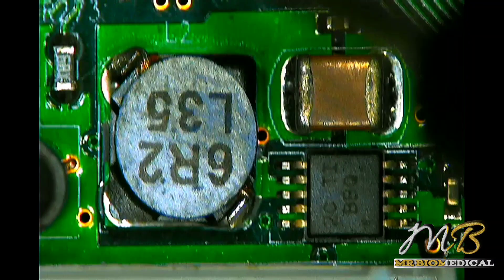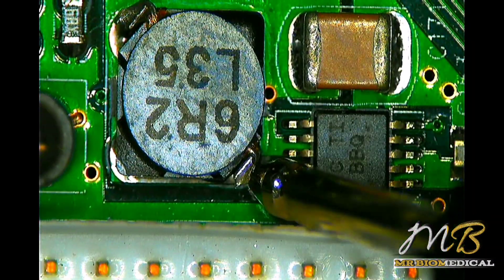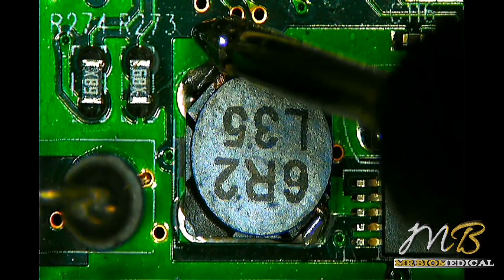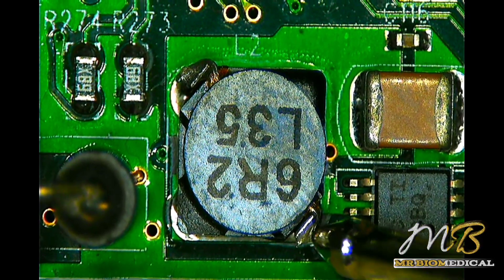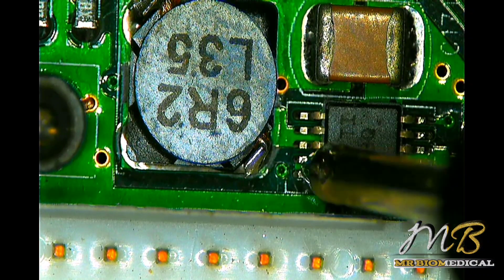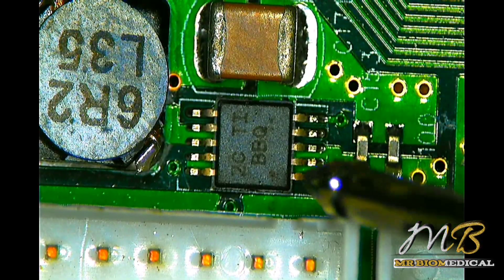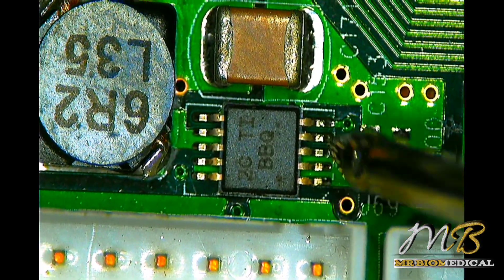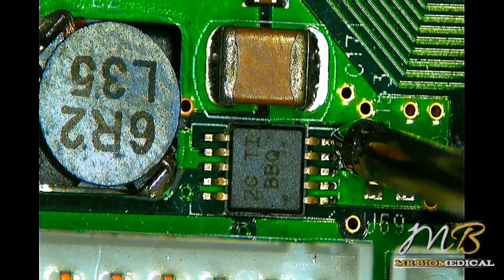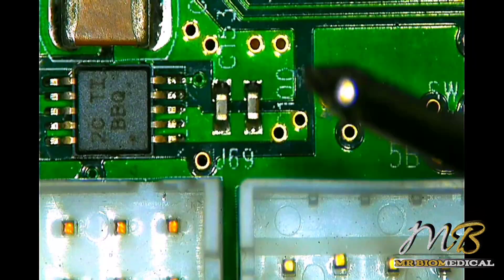First pin, second pin, third pin, fourth pin, fifth pin — short everywhere. The capacitor and inductor also show a short. If you are doing SMD repair and you get a short on an inductor, you can assume that some component on the board is shorted to ground. That is the easiest diagnostic method I always follow, though everyone has different tricks.